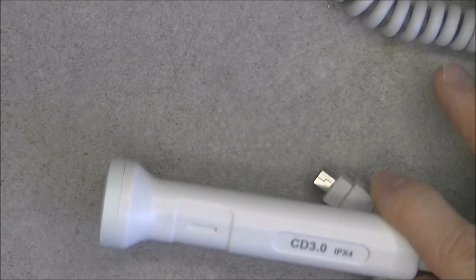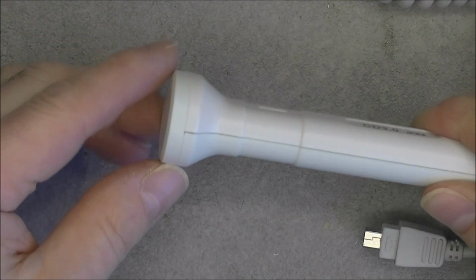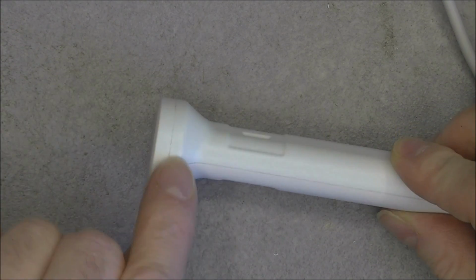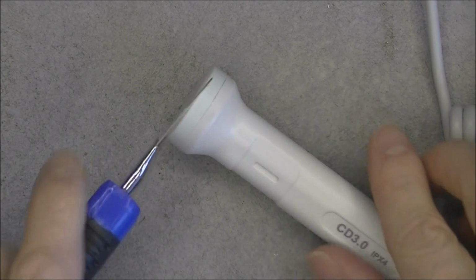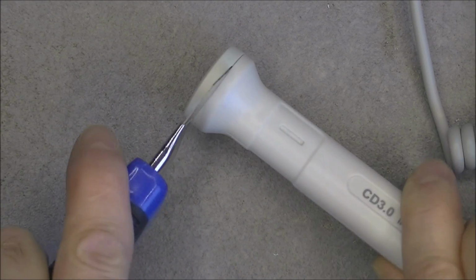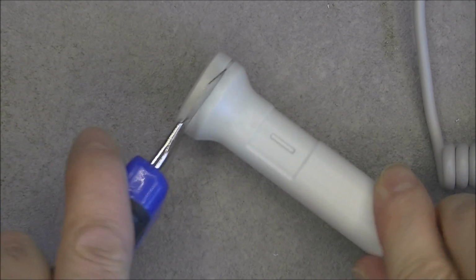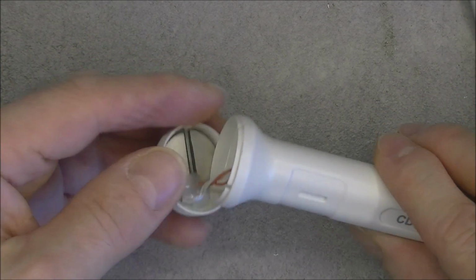Okay, now I will try to crack open the probe. So this probe, apparently we have one front piece here and two main pieces here, and everything is welded. So I will try to work the gap loose with a knife. So this front part was actually easier than expected.